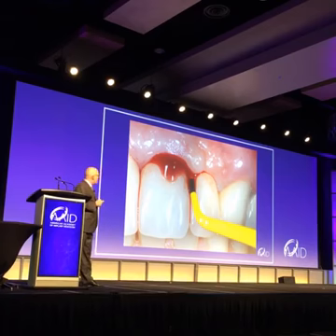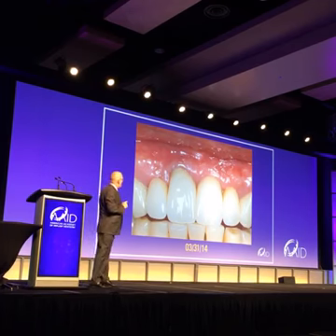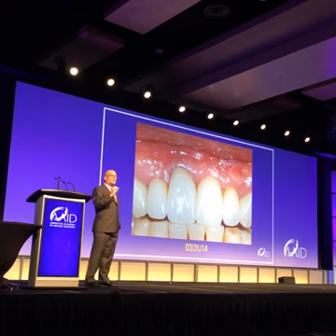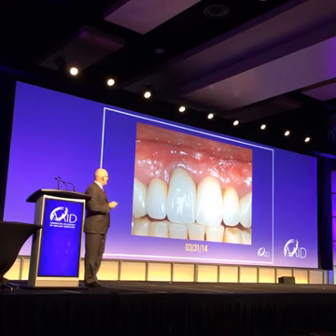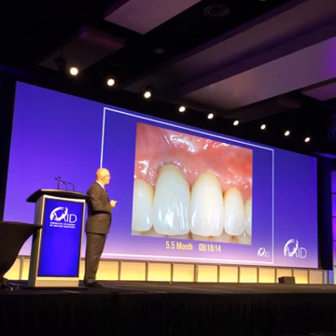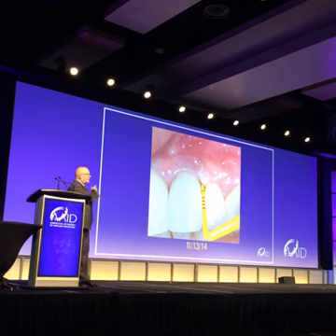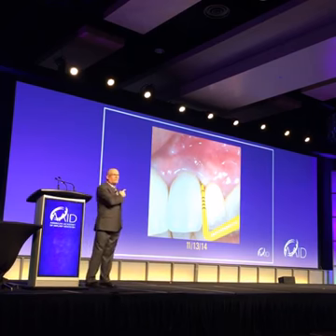You can see here's the 9mm pocket that we have on the distal of number 9. This is what she looked like a month later. We lost a little bit of tissue around the top of number 8, but number 9, you can see the resolution, how it's shrunk back in a month. 5.5 months later, it's looking about the same. She's happy with the aesthetics. She doesn't have a huge smile line, but it still looks very nice. But look at the pocket that was a 9 before, that was major bleeding. It's now a 3, and I'm pushing hard on that.